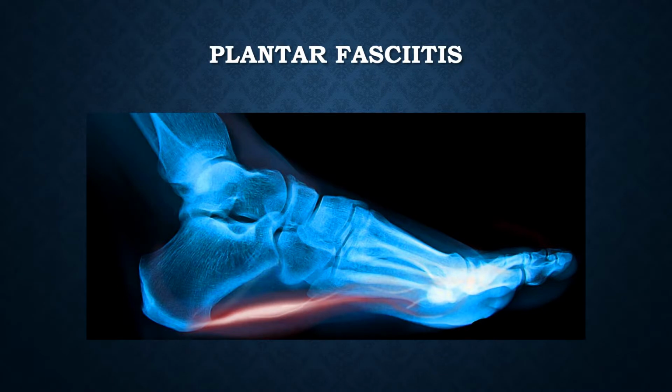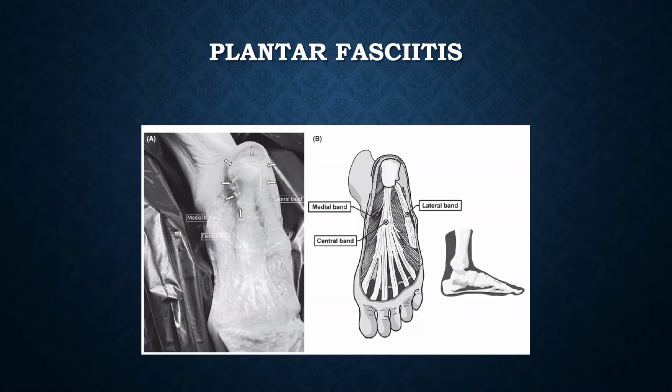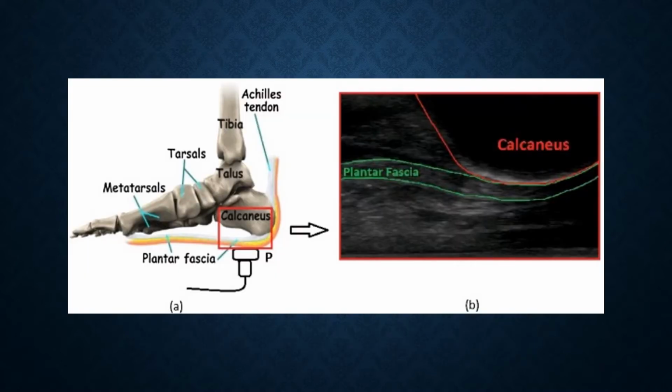Let's change gears now to another very common pathology that we see in the outpatient world, plantar fasciitis. Remember that the plantar fascia originates at the medial tubercle of the calcaneus and fans out along the sole of the foot. The most common pathological site for patients with plantar fascia pain is the enthesis at the calcaneus, so investigating this junction will be important.